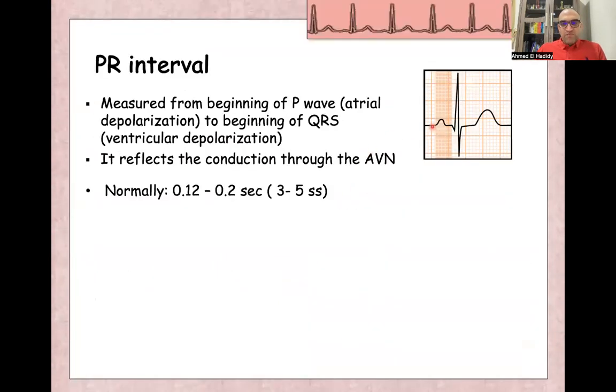After P wave, we'll have PR interval. PR interval is from the beginning of P wave till the beginning of the QRS complex, consists of the P wave itself and PR segment. It represents depolarization of the AV node or conduction of the AV node itself or delay in conduction of the AV node itself. We measure it from P wave, which is atrial depolarization, till the beginning of the ventricular depolarization.